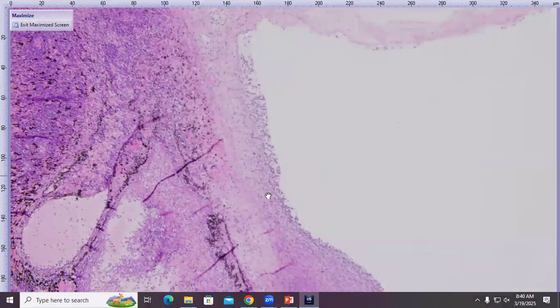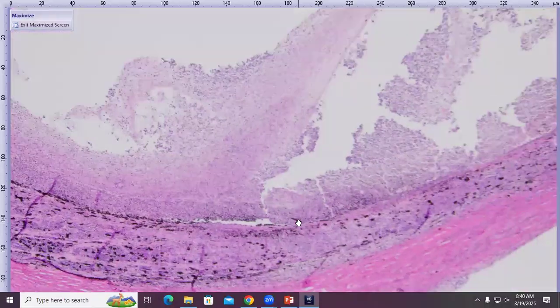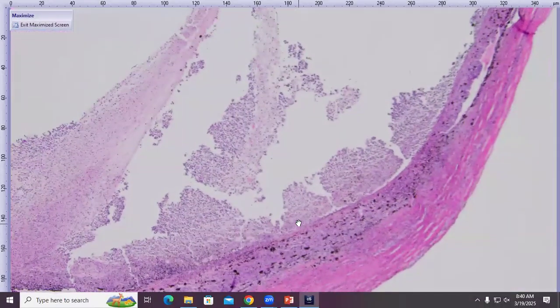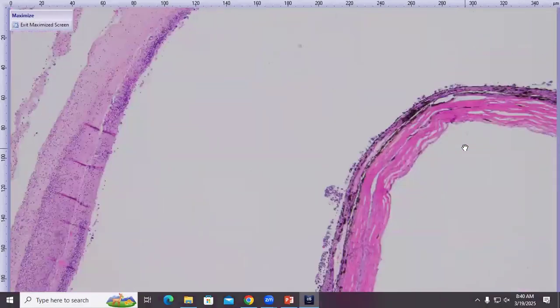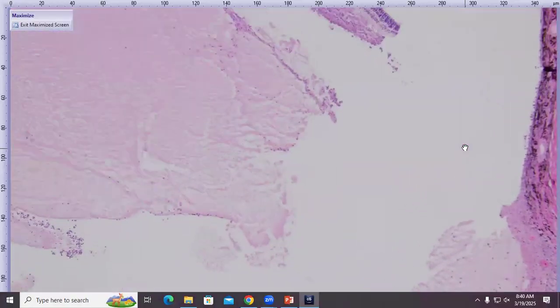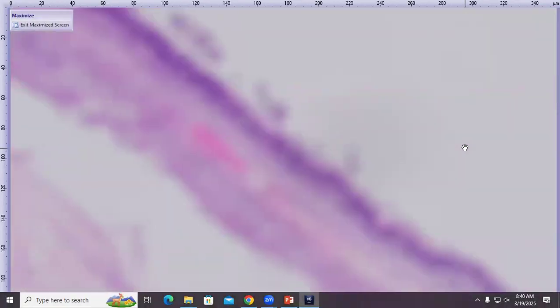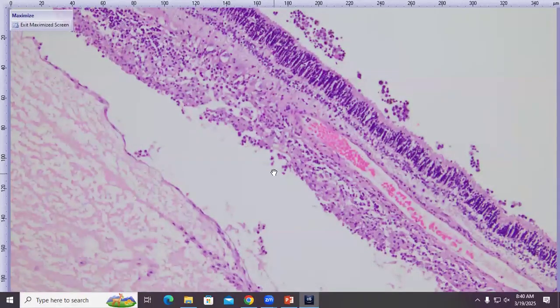So we can see this epithelioid carpet again carpets the rest of the uveal tract. We can see that lymphoplasmacytic inflammation also continues in the choroid. And if we head back towards the retina, it's a little thick and ragged because it has also got an epithelioid macrophage carpet to it as well.